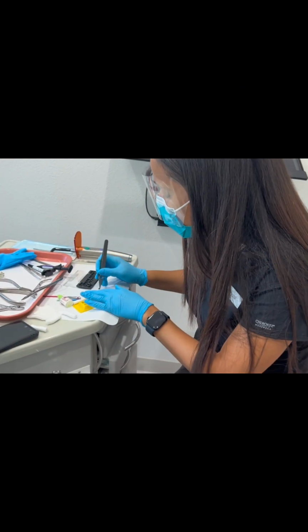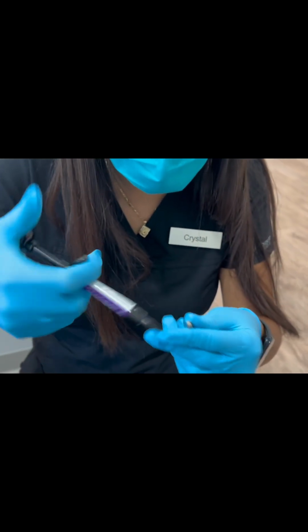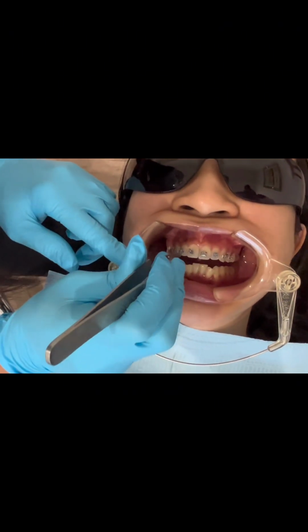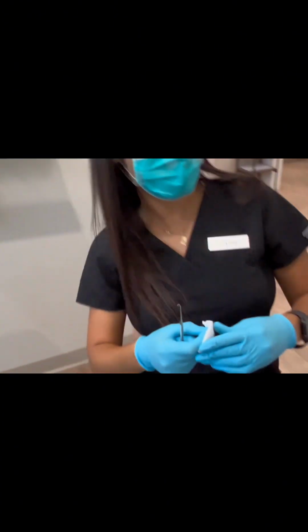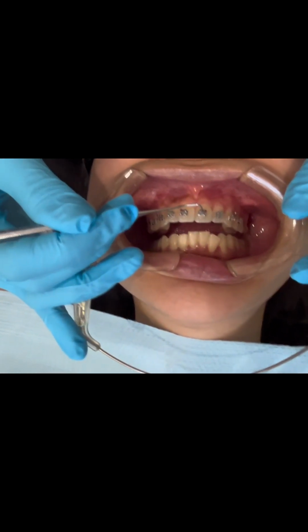Same thing. Pea size, little pea size, boom, just like that. Not a lot, all right? And put it in. Sometimes while I'm doing this, if I was doing the back ones, you'd be seeing me cover it every so often, just to make sure. Now I get my 2x2, and we're gonna clean some glue off. You're gonna go around, and you're gonna clean off the glue.